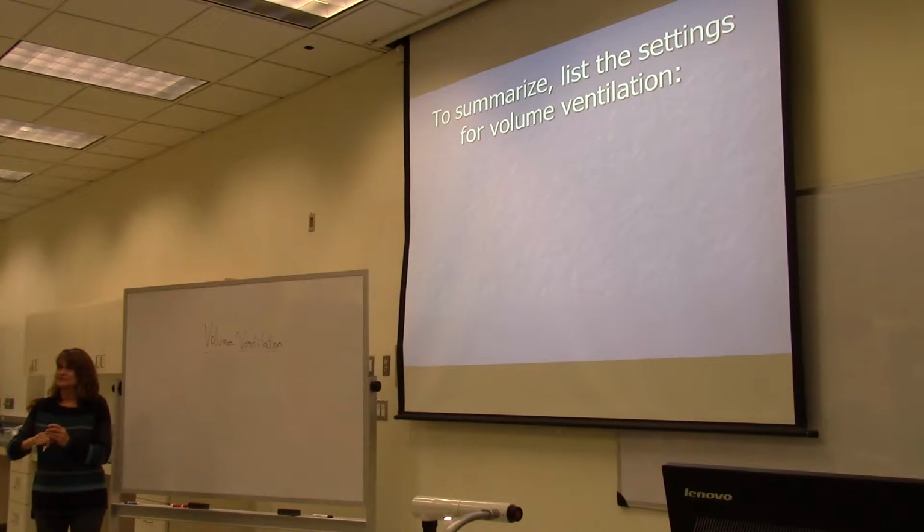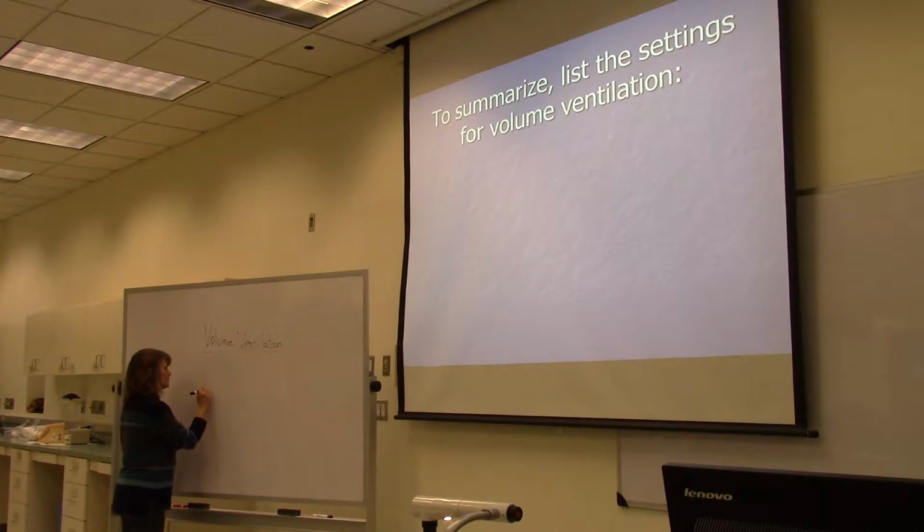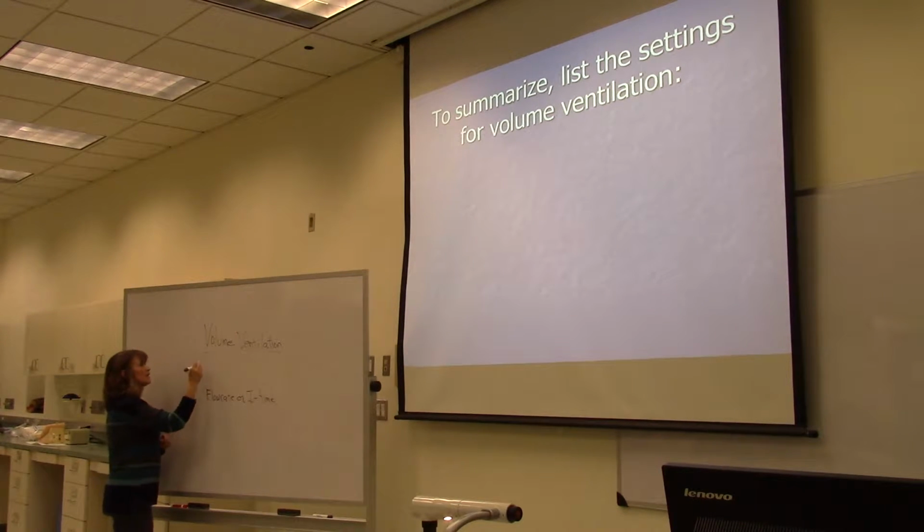What do we set? It can be out of order. Flow rate. Okay. I time. All right. Respiratory rate? Duration. Respiratory rate. Okay.